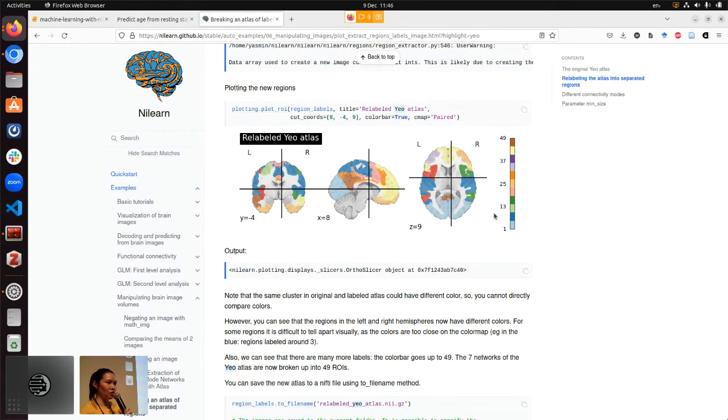But I understand especially for cognitive neuroscientists, you probably want to know more about what a single brain region does. In that case, it will make more sense to separate them out as isolated regions. So they're both perfectly valid choices. It's a great question. Thank you very much.